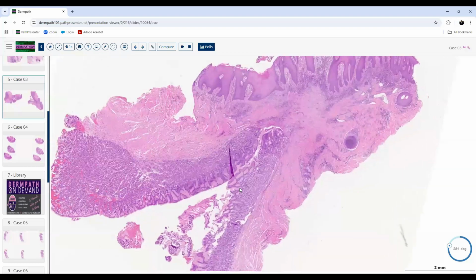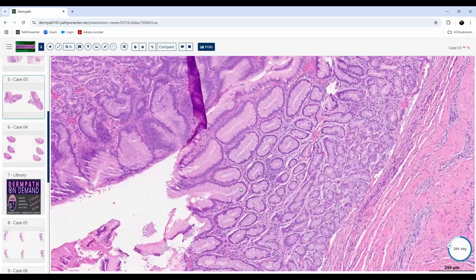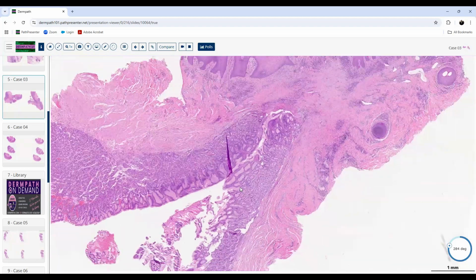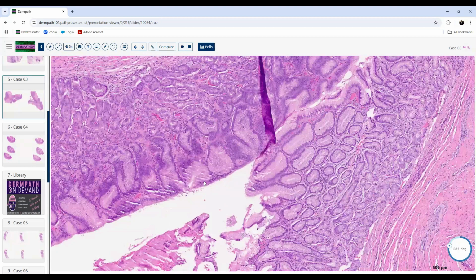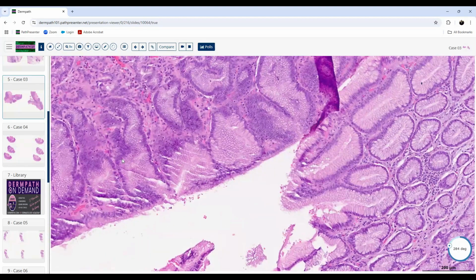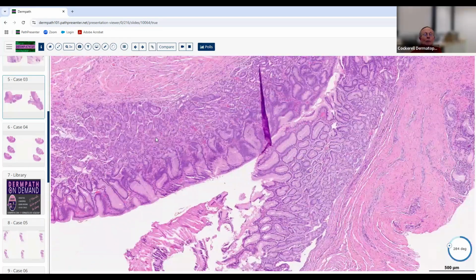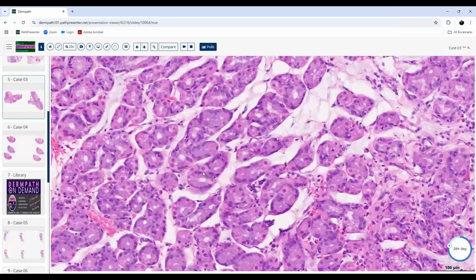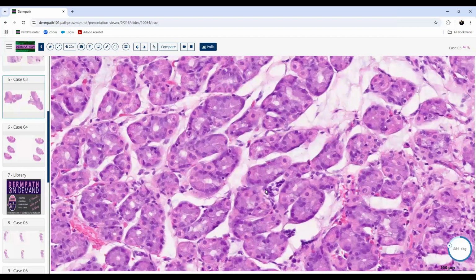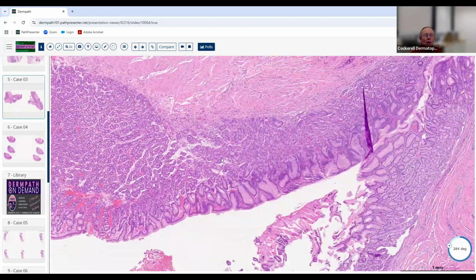So maybe like a PEG tube site or like an ostomy, or could be like a met to the skin potentially, but it looks pretty well differentiated and well organized. So I don't think it's a malignant process. Good. Yeah, I was going to ask you if you thought this might be malignant, and I agree. I don't think it's atypical at all. It looks very healthy. Yes, no mitoses, nothing along those lines.